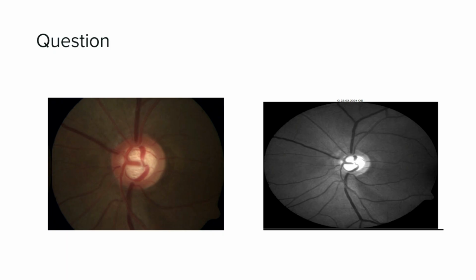What kind of cupping are you looking at? Initially what he showed was the color cupping. Later on you traced it correctly. That is contour cupping. So you should always look for contour cupping where you trace the blood vessel. That's the correct way of doing it. When you're looking at it, you should only look at the blood vessels, not the color.